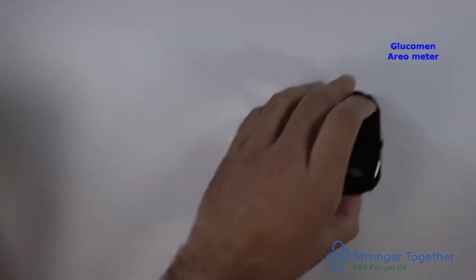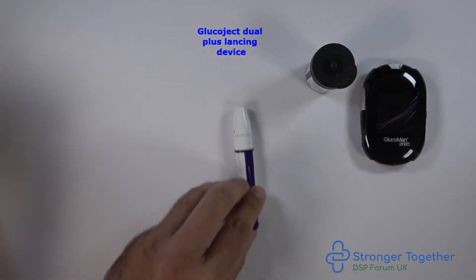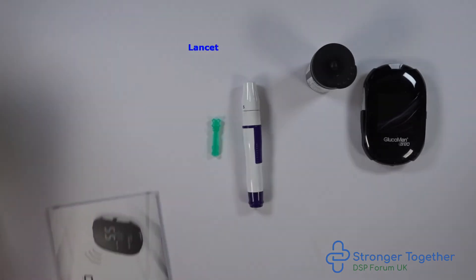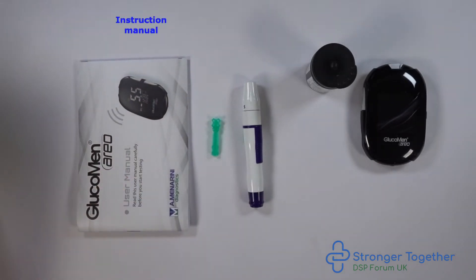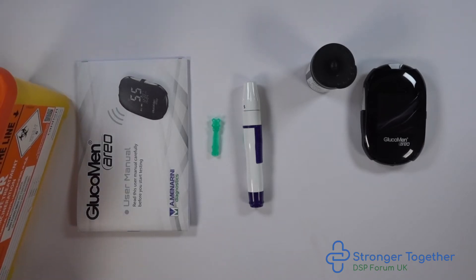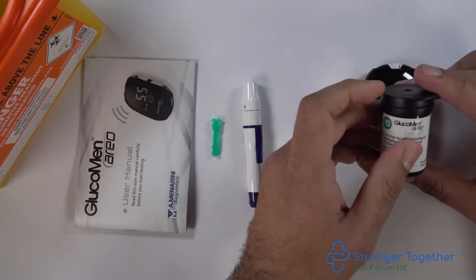We need our glucomine REO machine, our test strips, our glucoject lancing device, a lancet, our instruction manual and a sharps box. First of all, check the test strips are for your machine — in this case the glucomine REO device.